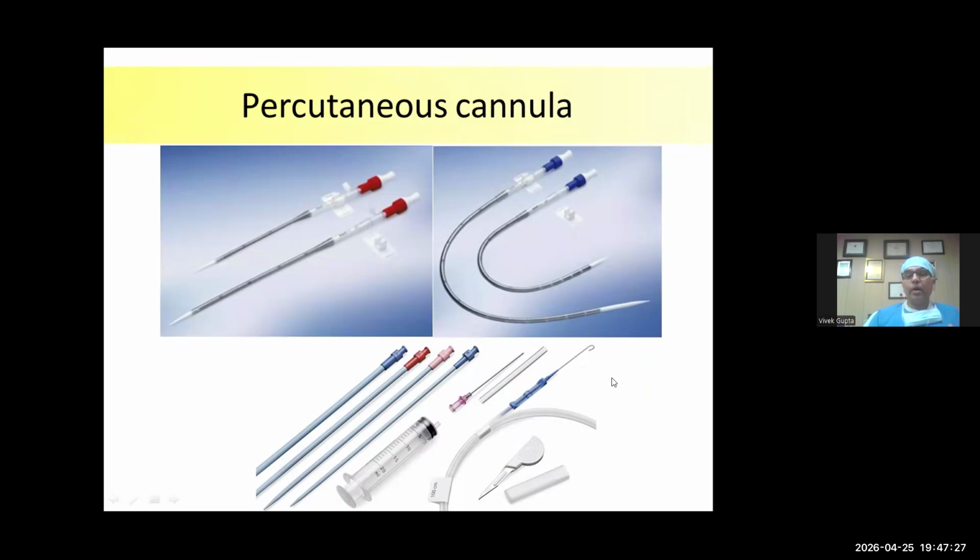One thing you must remember when you are doing a percutaneous cannulation: never force any dilator, any wire. If it is not going freely, it means you are not at the right place. Why is it important here? Because it's a very wide bore cannula, and if you pierce or puncture the vessel with the dilators, you damage the vessel, then you can't put these patients on it. And it will be a failure. You will lose your patient. So be very, very careful. Never force dilators or cannula.